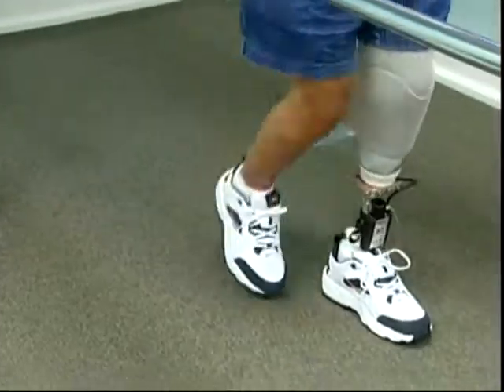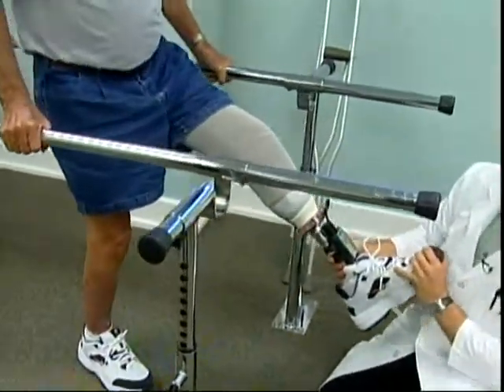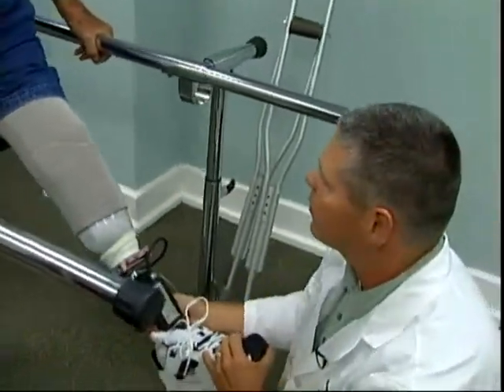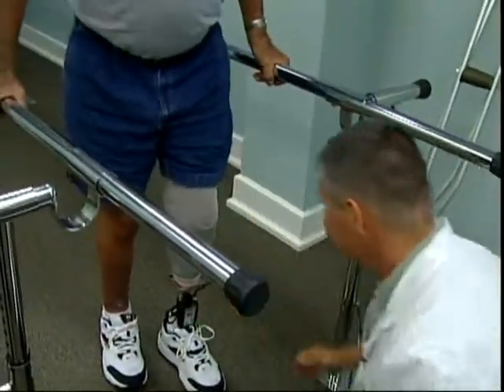I don't have that toe pressure anymore either. Wonderful. So here, hold your leg up. Here's what's really amazing. This device is truly a part of him now. There is no displacement whatsoever with the vacuum system. When he moves, the prosthesis moves. So he now has 100% control over this thing.